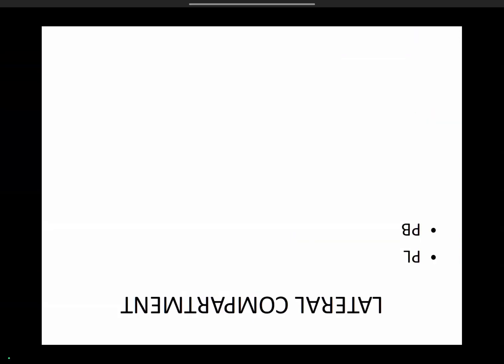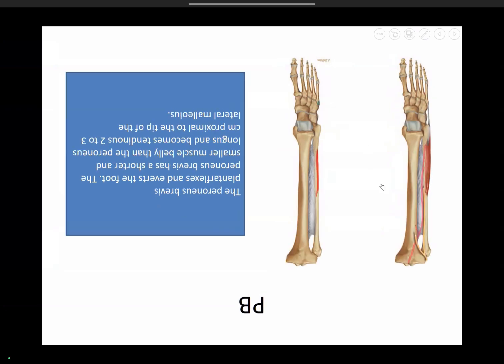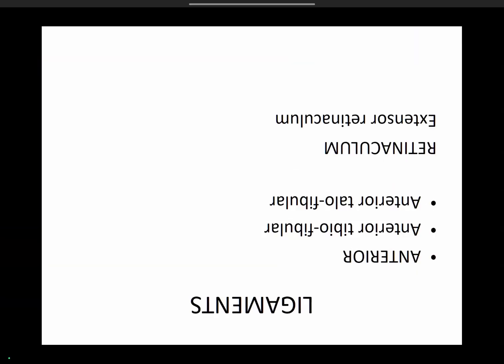Peroneus longus is called longus because it has a very long tendon. It is a bulky muscle with a long slender tendon that passes through the peroneal tuberosity at the calcaneum, then into the sole of the foot through the tunnel of the cuboid bone, and inserts over the base of the first metatarsal and the medial cuneiform. It is an evertor of the foot. Peroneus brevis has a shorter tendon and inserts at the base of the fifth metatarsal.